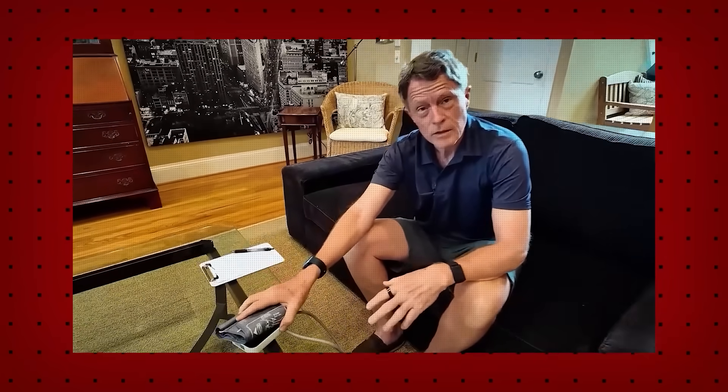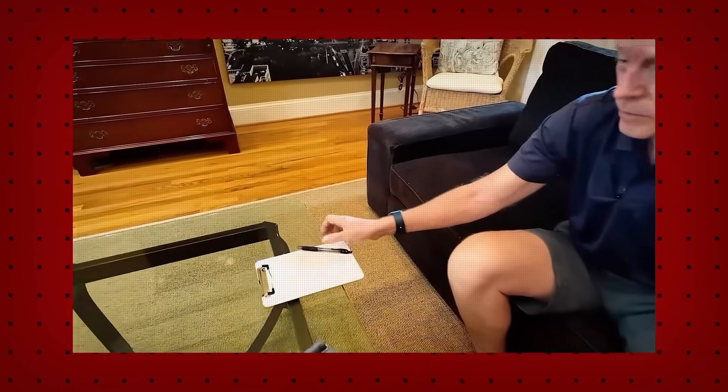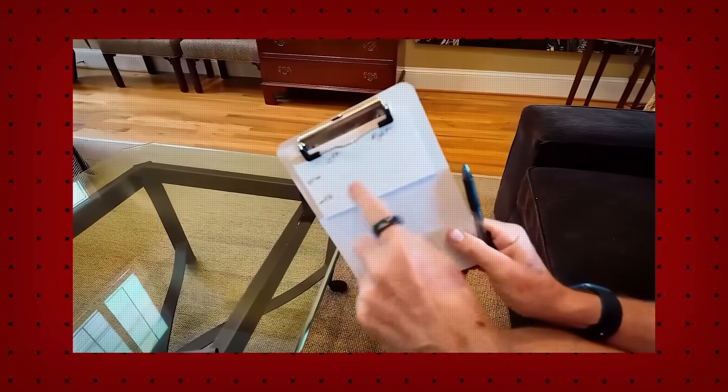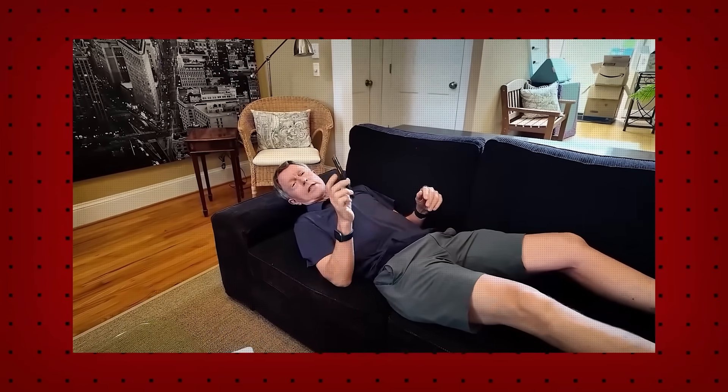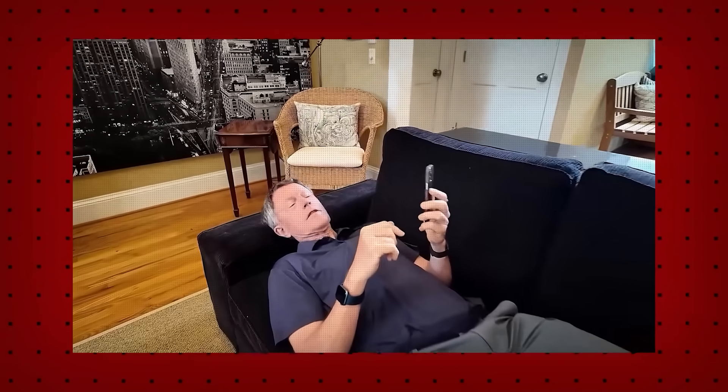I've got my blood pressure cuff, a pen and paper, and I've labeled it left arm and ankle, right arm and ankle. I've got a couch to lay down on, and an iPhone to fiddle around with while I'm resting. [Interjection: This resting part is important — it will make a big difference on your values. Be sure to rest for five minutes. Also, this probably shouldn't be done after you've consumed a stimulant like caffeine.]